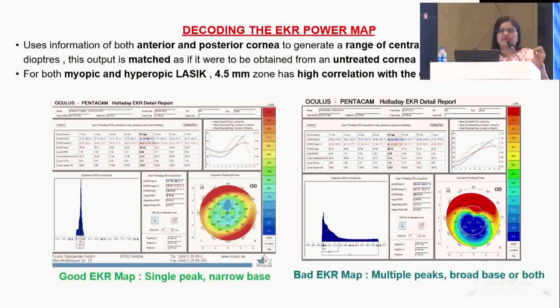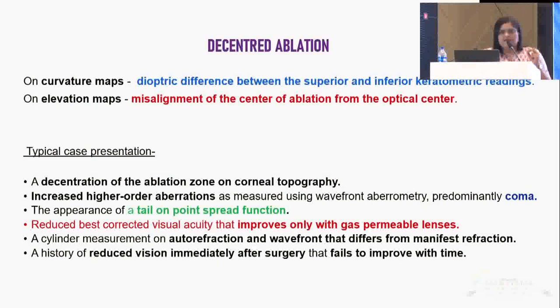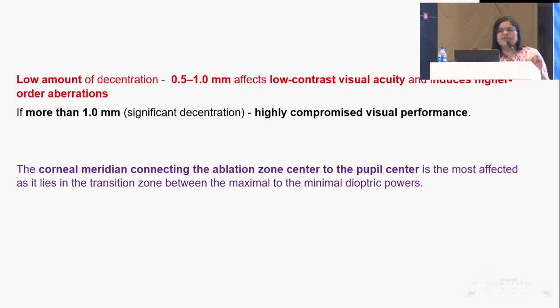With decentered ablation, the typical case presentation will have a decentered ablation zone along with increased higher-order aberrations, along with a tail on the point spread function, with reduced BCVA that improves only with gas permeable lenses, along with a cylindrical measurement on autorefraction and wavefront that differs from manifest refraction. Also a history of reduced vision immediately after surgery that fails to improve with time. That is what you will get. Now, the corneal meridian connecting the ablation zone center to the pupil center is the most affected, as it lies in the transition zone between the maximal and the minimal dioptric powers.